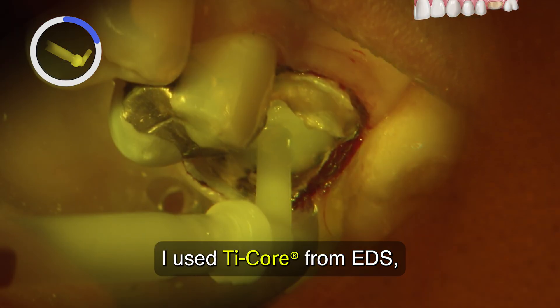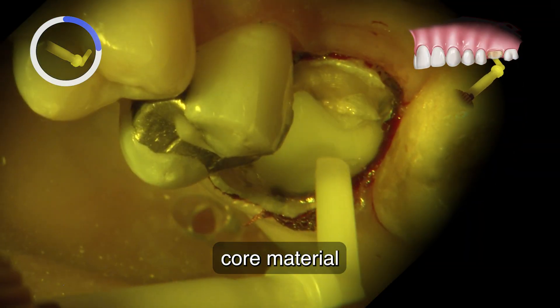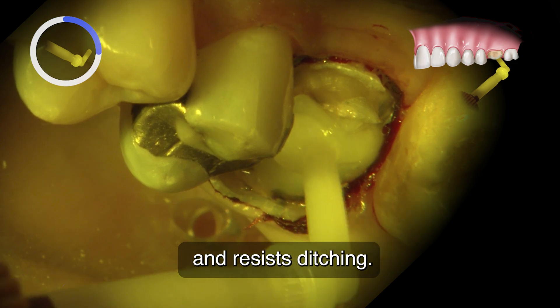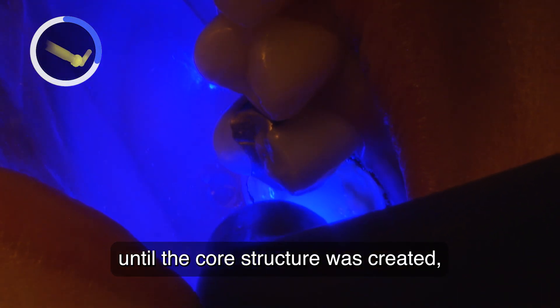Next, light cure for 20 seconds. I use Tycore from EDS, which is a reinforced composite core material that preps like dentin and resists ditching. I place it in layers and light cure until the core structure is created.